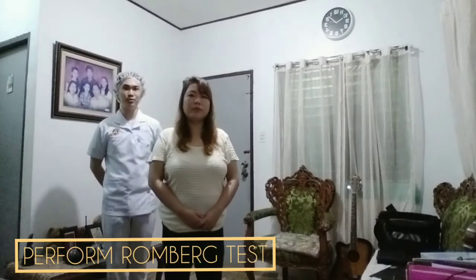In the Rinne test, I'm going to compare the air conduction and the bone conduction. So now I'm going to ask you, do you hear any vibration or sound? No. How about now? Yes. Okay, so in here, the AC is twice as long as the BC. Now I'm going to proceed to the last part, which is performing the Romberg test.